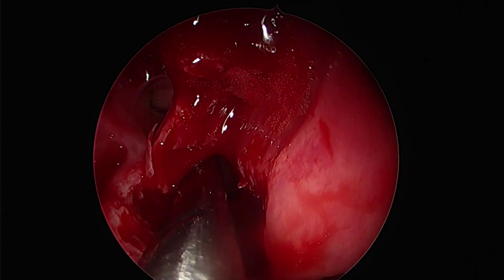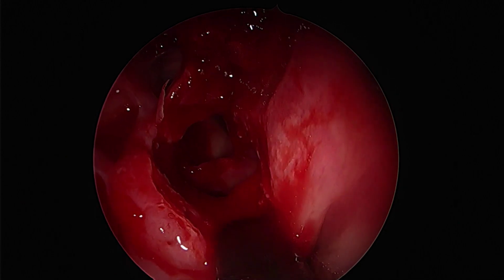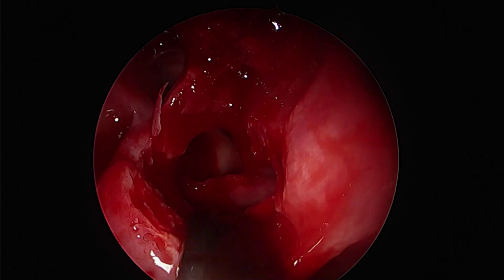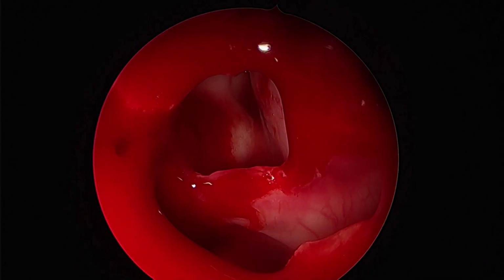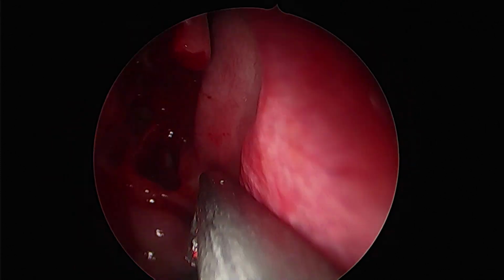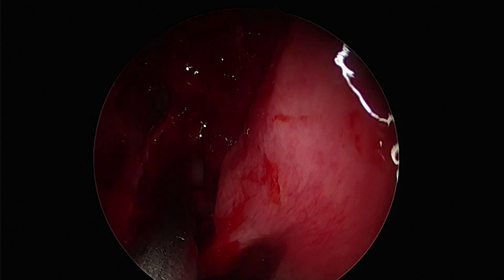We can see a ledge of bone here which separates the Onodi from the rest of the posterior ethmoidal and the anterior ethmoidal cavity. We seem to be pushing this mucosa on the anterior face of sphenoid slightly down to put our septal branch of sphenopalatine further lower to remove some more bone. We use the same bone punch to remove some more bone.